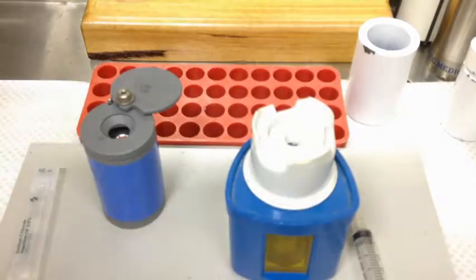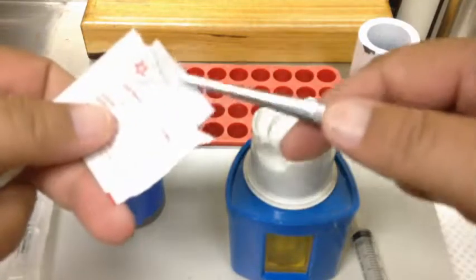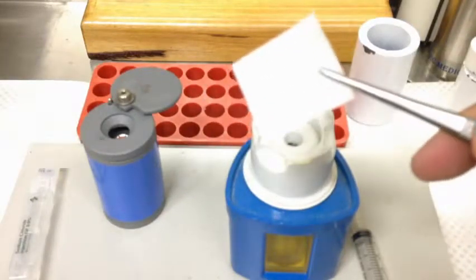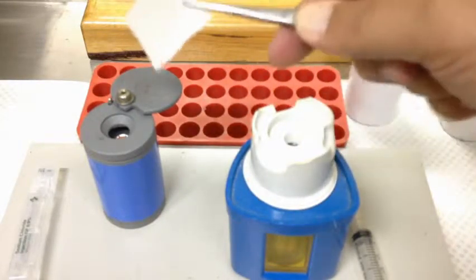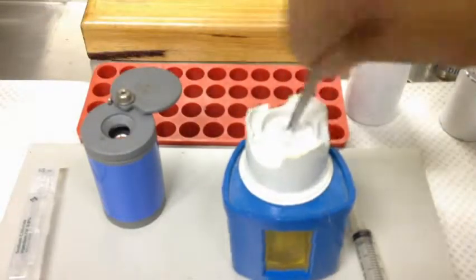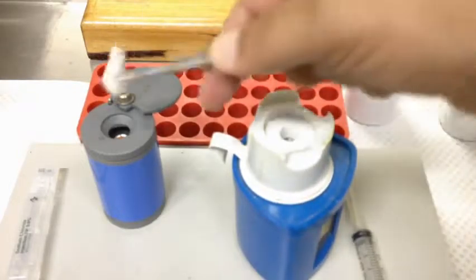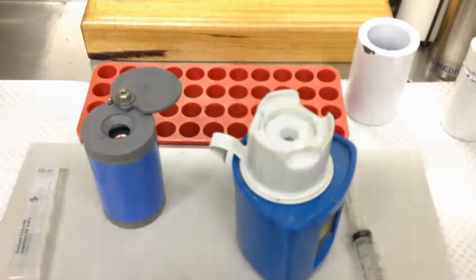Obviously the first thing we need to do is decontaminate. The approach that I like to take is I don't move from hot to cold — I move from cold to hot. So I wiggle it around the cold one first, then I wiggle it around and decontaminate the hot one. That way I'm not transferring any contamination in that direction. And then that goes in the hot bin.